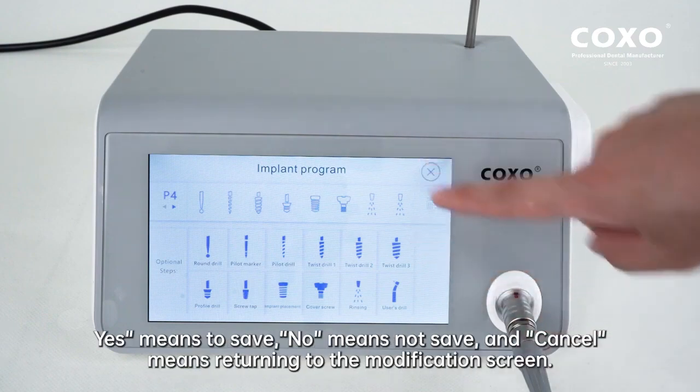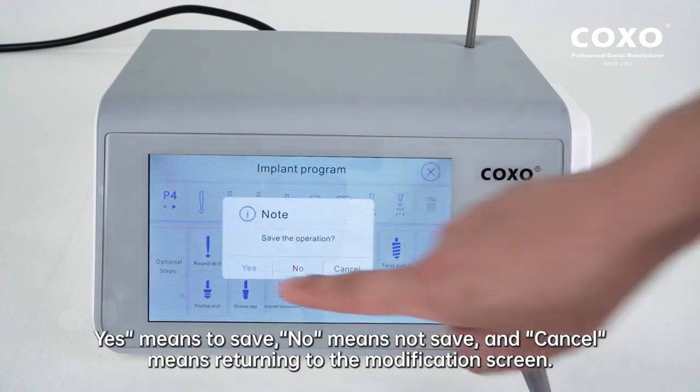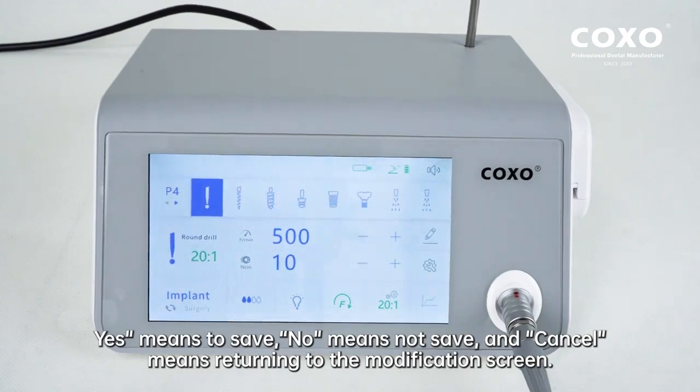When saving a program: Yes means to save, No means not save, and Cancel means returning to the modification screen.